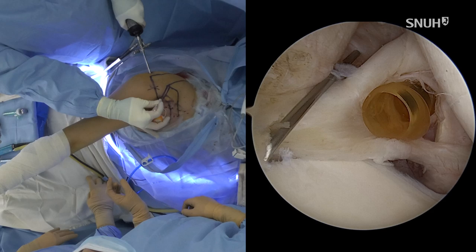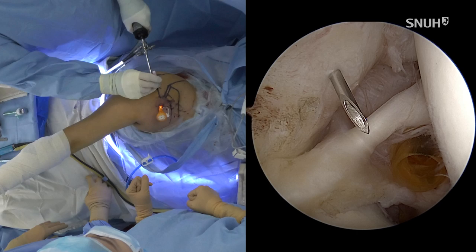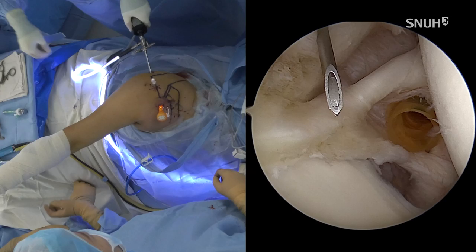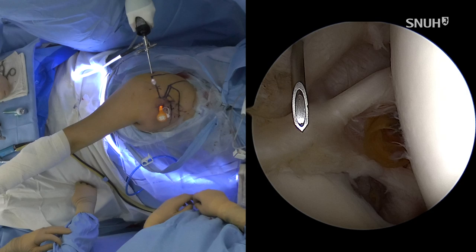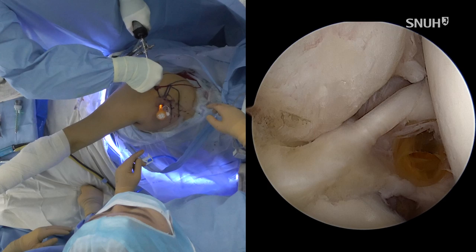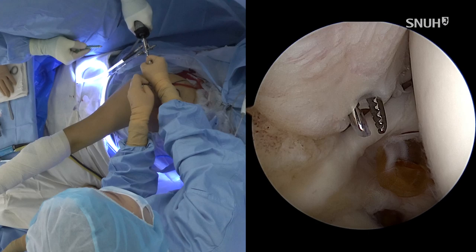So I like to use the transrotator cuff portal, but not through the tendon, but through this muscle tendon junction area. So this is good for the SLAP repair. Just lateral to the acromion, you can separate the muscle tendon junction area with this straight hemostat. According to my paper, there is no remaining partial tear.